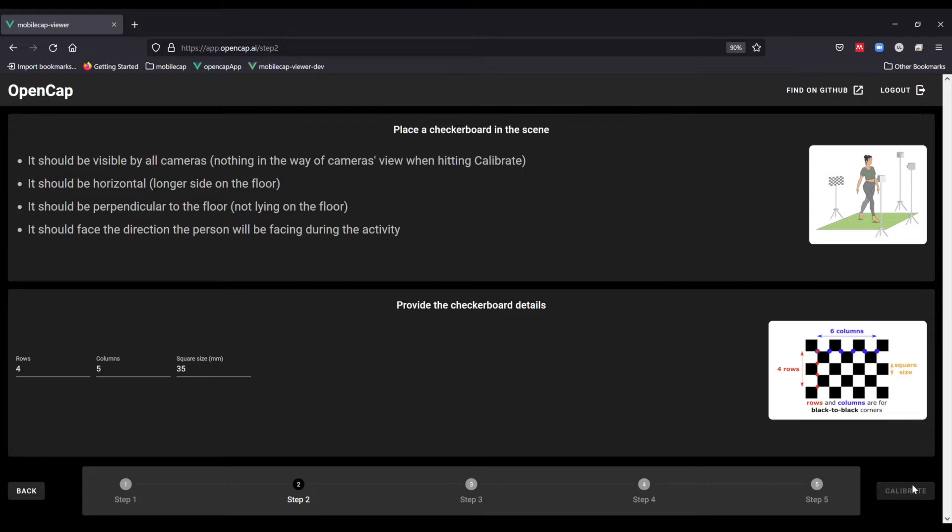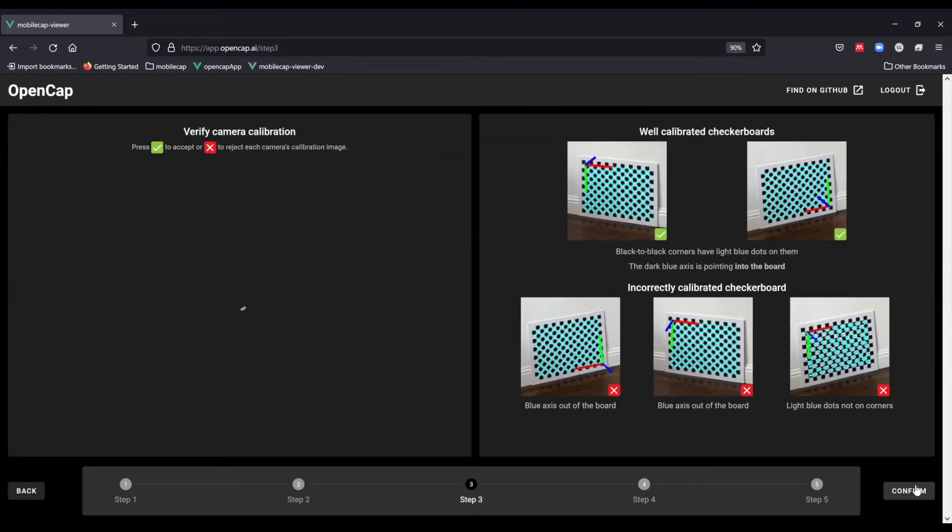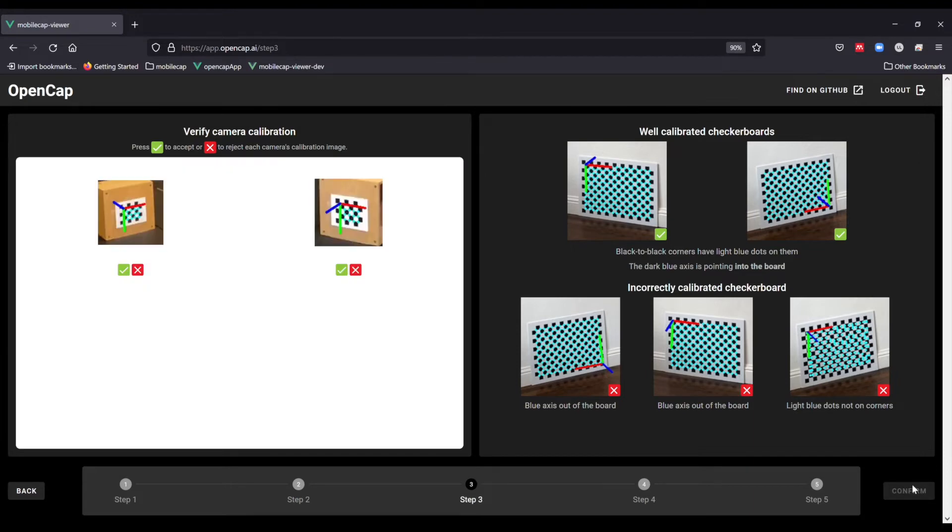You can next hit calibrate and the calibration will be processed in the cloud. On the left hand side of the screen, you are then shown images of the calibration results. Like the example images on the right side of the screen, a successful calibration will have blue dots on the interior black-to-black corners of the checkerboard.